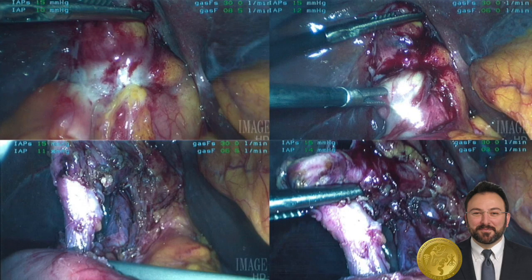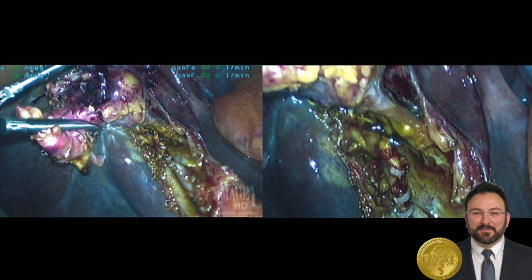The surgeon encountered an inflamed gallbladder with pus draining from the gallbladder wall. Omentum and duodenum were stuck. There was edema and inflammation, and he opted to fire a stapler across what appeared to be the infundibulum of the gallbladder. Some bile was then noted to be leaking from the cystic plate, which was clipped.